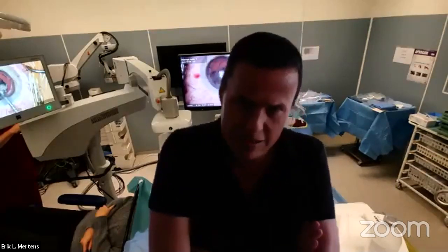All right. And this is another interesting question. If we don't have an anterior segment OCT, what would you do now? Well, I would still do UBM, because UBM was pretty good. I would also go back to white to white and UBM and compare them. And when they give the same result, the same ICL size, I would go for that. So I would do both methods instead of the anterior segment OCT.